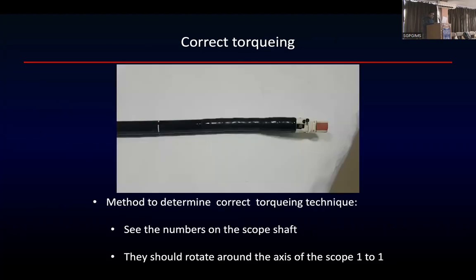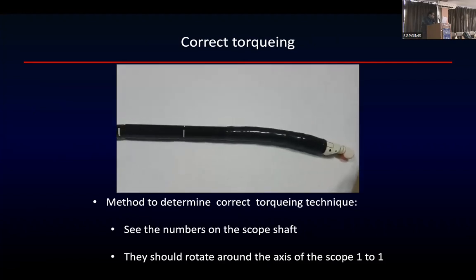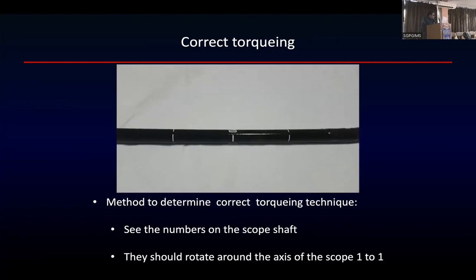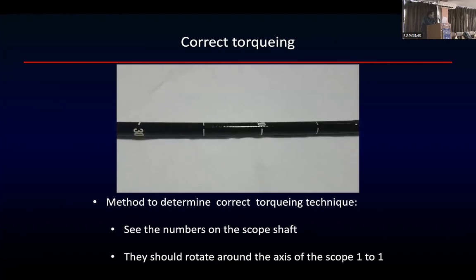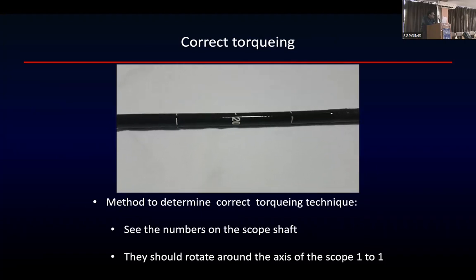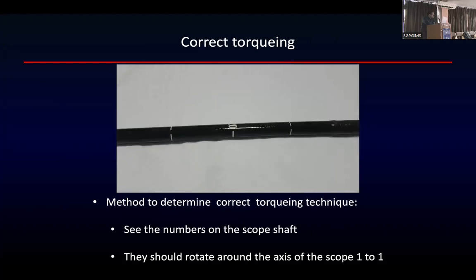So how do you know you are torquing it right? You need to see the numbers on the scope shaft. They should rotate around the axis of the scope. What does that mean? If you see this, we are rotating the scope and the numbers are moving. If it's happening this way, this is the right technique of torquing. This looks very simple, but what I can tell you is you can torque the scope in many different ways and you won't be doing it right. So see the numbers on the scope shaft; they should rotate around the axis of the scope 1 to 1. That's what torquing is. This is what you are doing throughout when you are using an EUS scope.